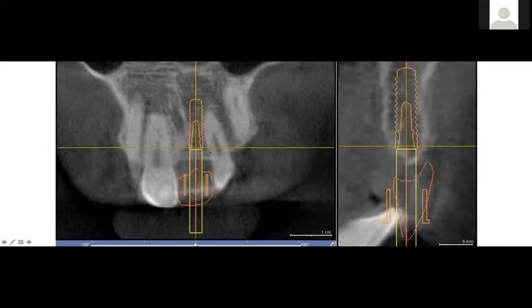Now, thank God, or for our purposes, most importantly, we're away from the root here in the crestal area, which matters as far as the papilla goes, by about 1 millimeter, a little more than 1 millimeter. So this should ideally be 1.5 millimeters, which we didn't have here, but at least 1 millimeter. So here we're about 1.2 millimeters away from this adjacent root.